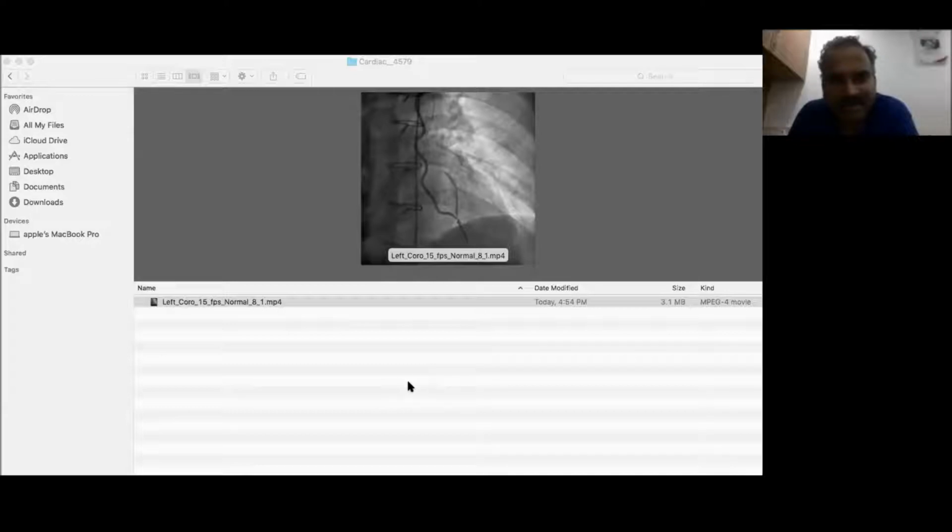Yes, sir. See, this is the LIMA injection. This patient came post-CABG, almost 10 years old, with non-STEMI, severe LV dysfunction, and decompensated LV failure. Admitted, not able to stabilize with conservative strategy. We don't have any information on the grafts, so I did a CT angio first, and then we subsequently took him for intervention. See, this is almost beyond 10 years. There is a tight lesion at the anastomosis. There is a lateral view.